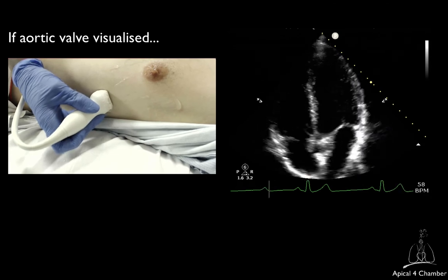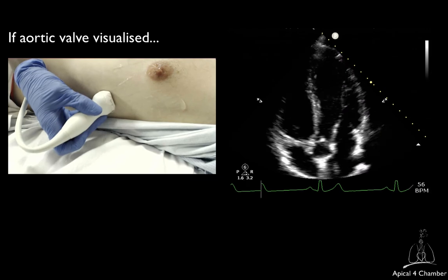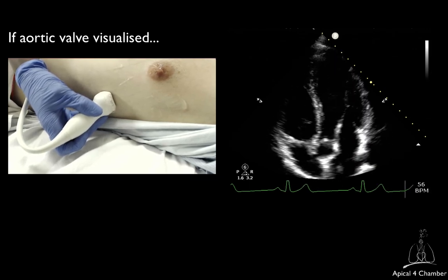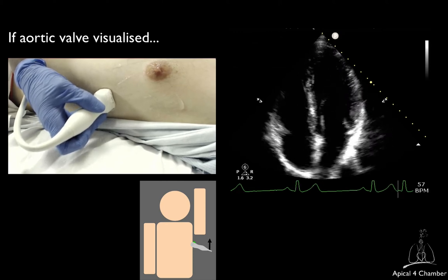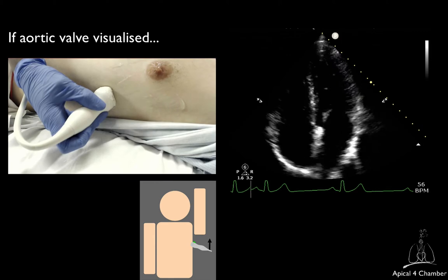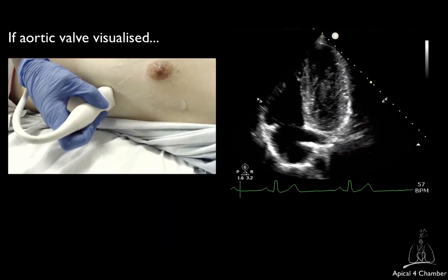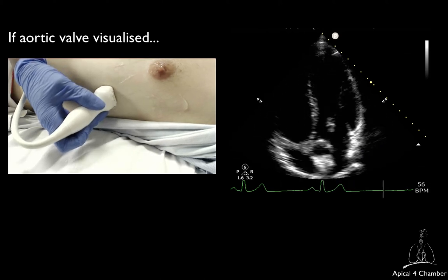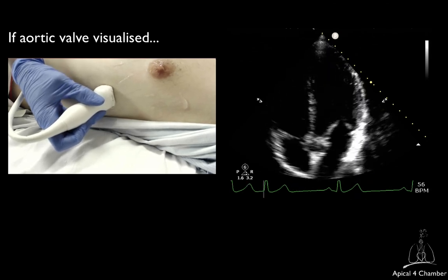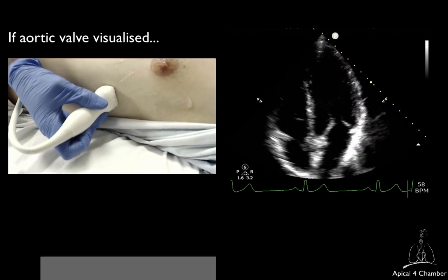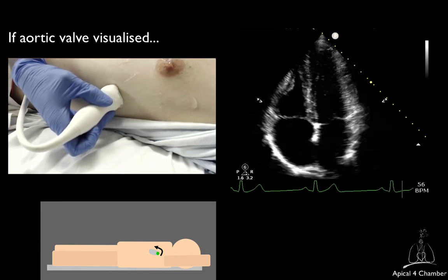On the other hand, if you visualize the aortic valve, you are directing the ultrasound beam too anteriorly. You will therefore have to tilt the transducer tail upward to direct the ultrasound beam more posteriorly. In some patients, you will not be able to find any intermediate view between the aortic valve and the coronary sinus view. In this case, from the aortic valve view, try to apply a very small counterclockwise rotation of the transducer. This rotation may enable you to get an adequate 4-chamber view.